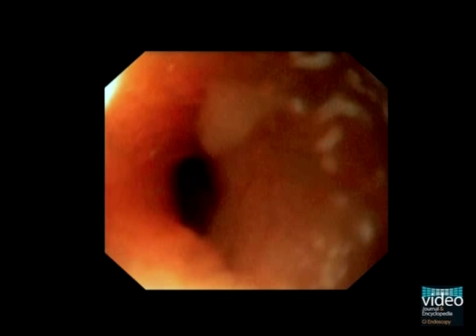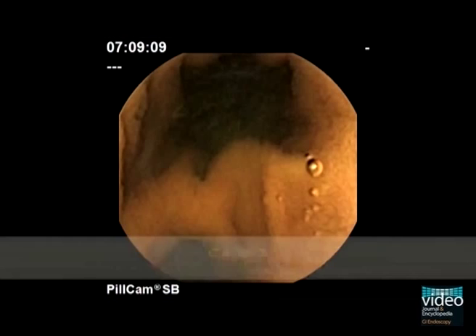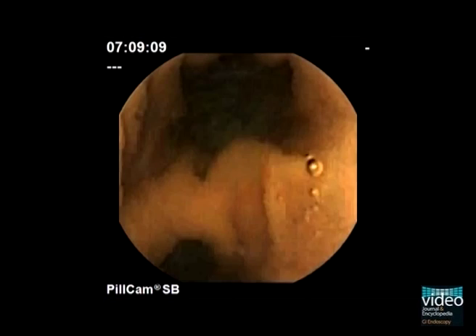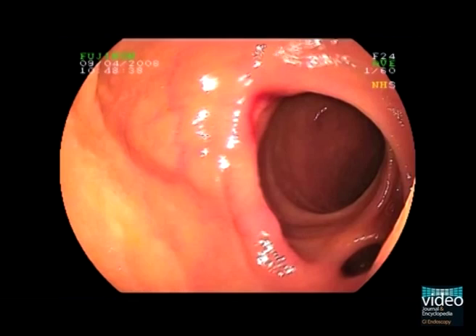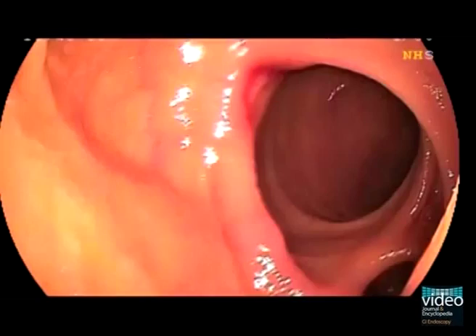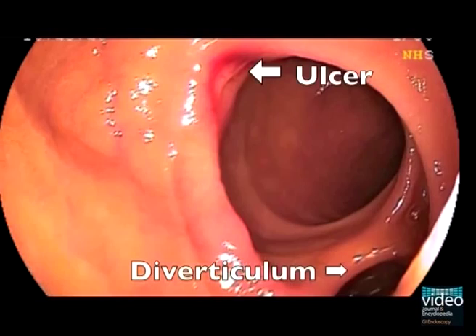This 75-year-old patient on clopidogrel for coronary heart disease suffered from severe anemia. Capsule endoscopy showed an ulcer with elevated margins and two lumina in the ileum for more than one hour. Retrograde double balloon enteroscopy confirms the ulcer opposite to the orifice of the diverticulum. A very thin circular ulceration around the orifice is seen as well.